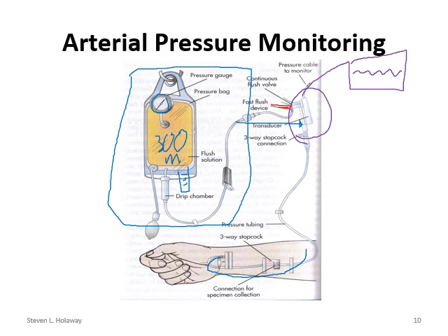Most of the time you're going to have an extra stopcock. It'll either be at the bottom or the top of the transducer, depending on what system you're working with. But again, as nurses, this is the whole system when we look at it: a pressurized bag, a transducer, a catheter of some type that's delivering pressure back to the transducer, and then the monitoring system that it's plugged into.